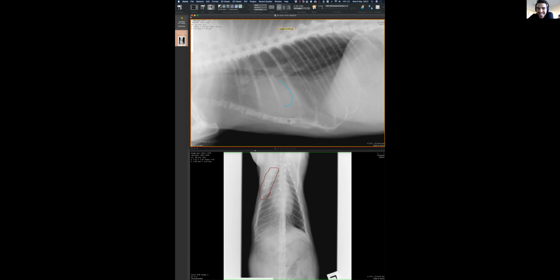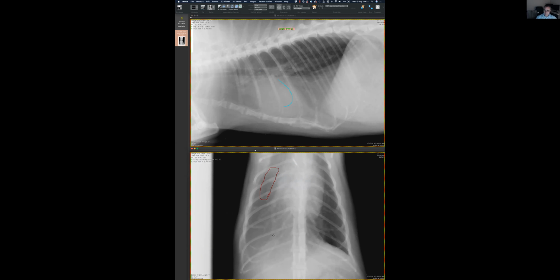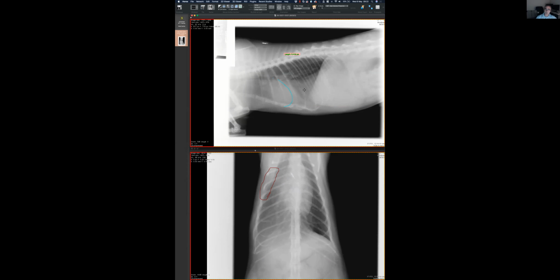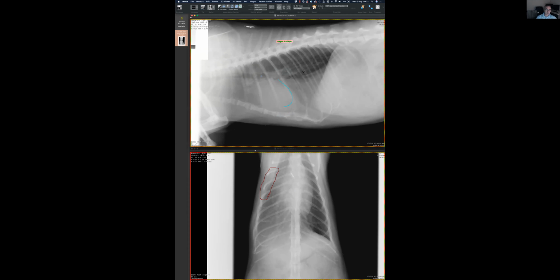If that is the case, first, I think I can see vessels. But probably more important, that is against your own description of you being able to see the contour of the heart. If there is so much opacity in that lung, the opacity in the lung should go against the heart. Makes sense? If you go in the book, it is going to say that in an example of an aspiration pneumonia, there is increased opacity within that lobe. And if there is enough fluid in that lung, and that lung is in contact with the heart, you should erase the contour of the heart. It's the same principle.